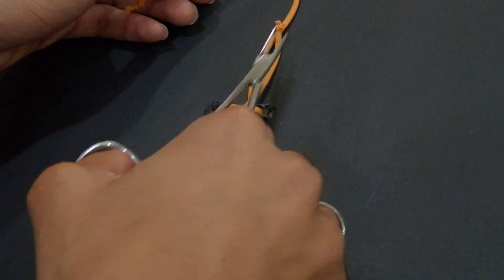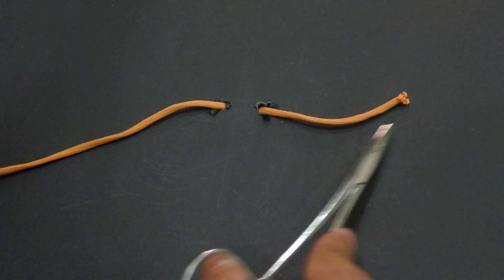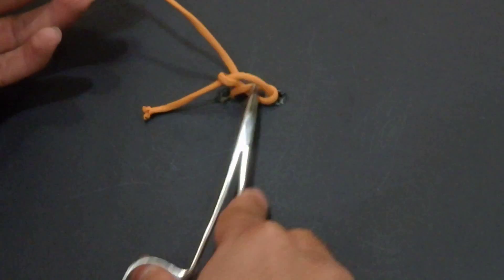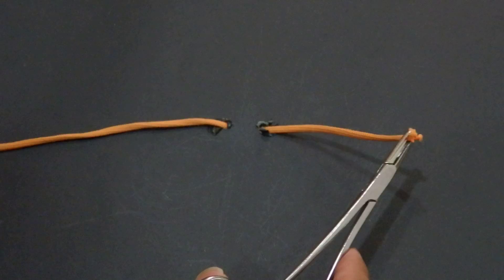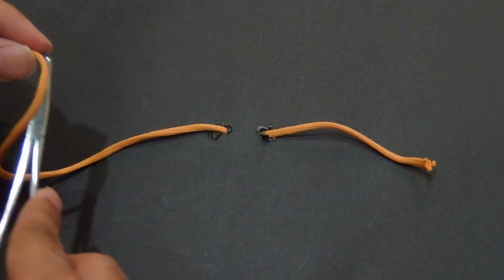The third mistake is that they do not change the direction of the free end — they bring it toward one side and then the other toward that same side, and they continue, which will result in an inappropriate knot.